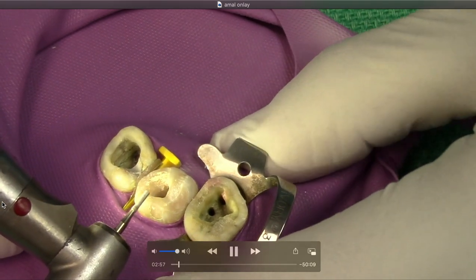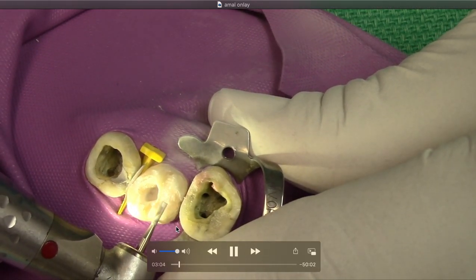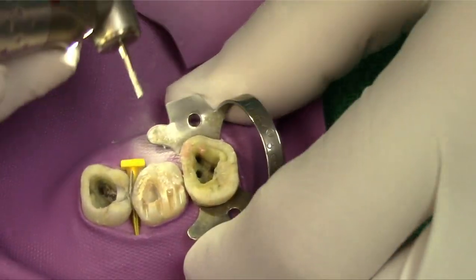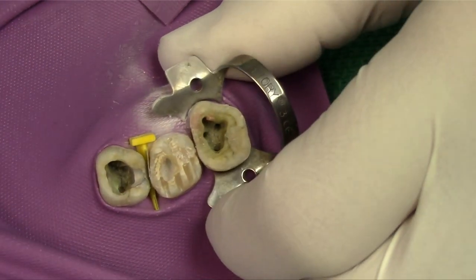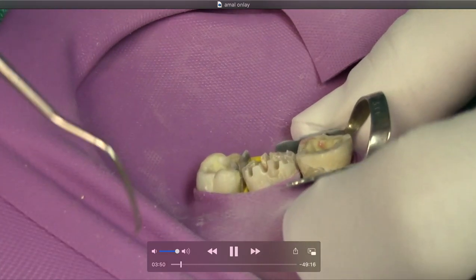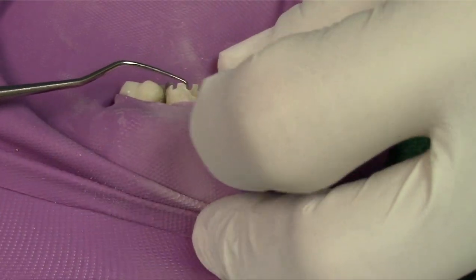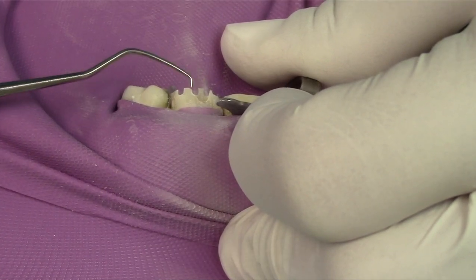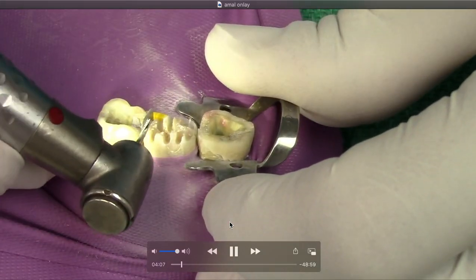We're going to start with our depth cuts. I'm using a 557 bur. The key thing that's really important is to know the diameter of your burs. The 557 is a one-millimeter diameter bur, so our depth cuts need to be double — two millimeters deep. A really quick way to check clinically if you're at the right depth is to use this end of the explorer, which is actually two millimeters long, so you can quickly assess intra-orally whether you've got two millimeters depth.